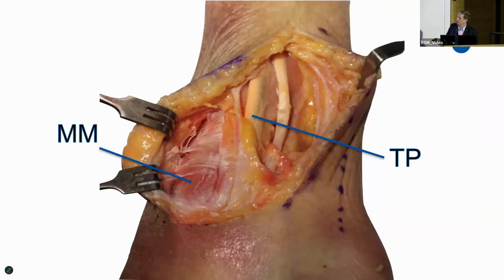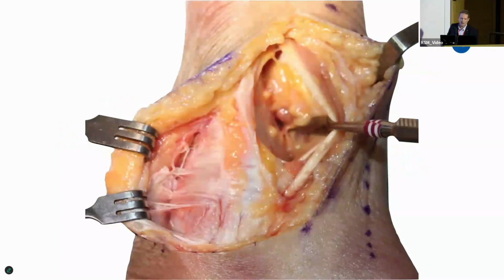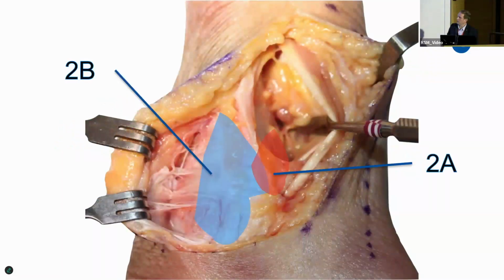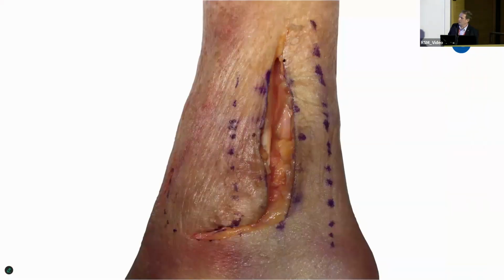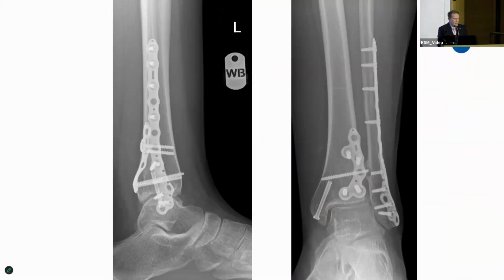And you can bring it further forward and get to your medial mal and even to your anterior colliculus, so you can expose pretty much all the tibia. And again, it's a very safe approach. This is the kind of metalwork you get in even through this small incision, and it's very easy to repair afterwards. So just an example. So this one, it was a bit of a malreduction. Most when the screw broke, it actually reduced itself.